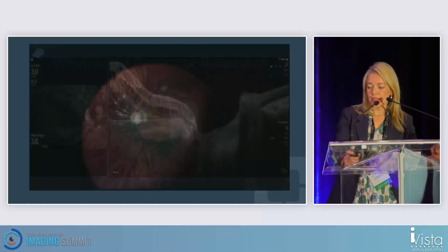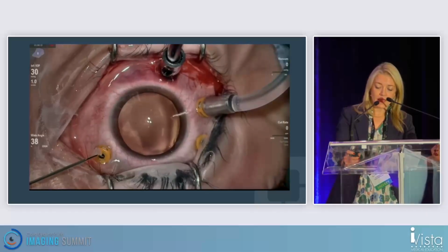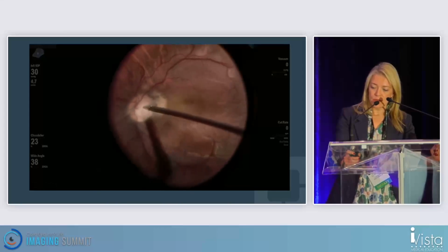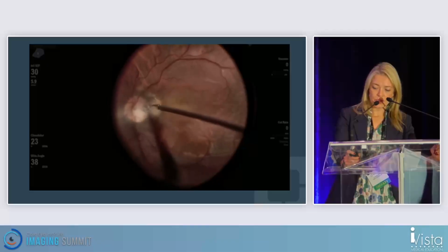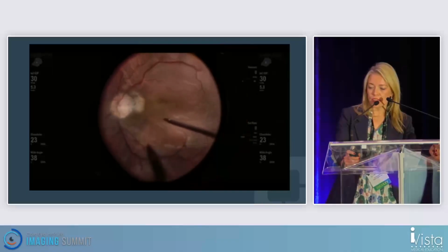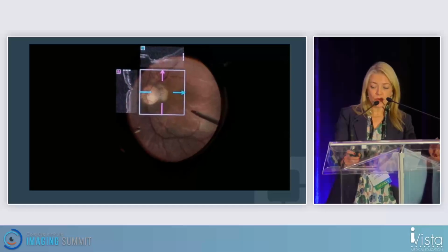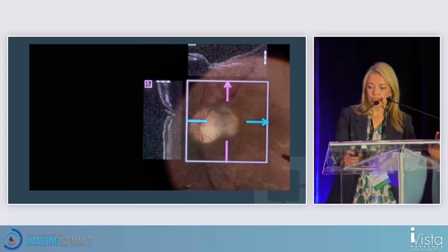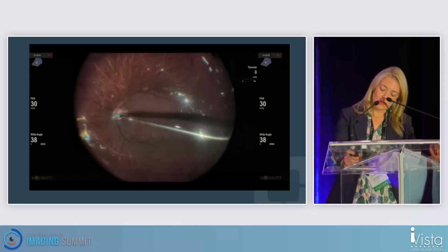And in this case, we decide to do the amniotic membrane graft. And I think it's really important that the position of the graft is appropriate. I'm using here a bimanual technique and ensuring that it's positioned in the pit without damage to any structures. And you'll see here that I'm using intraoperative OCT to confirm the position. But what's more important is that next I'm going to go to air, and I just want to make sure that there's no dislodgement or movement as I continue in my surgery.